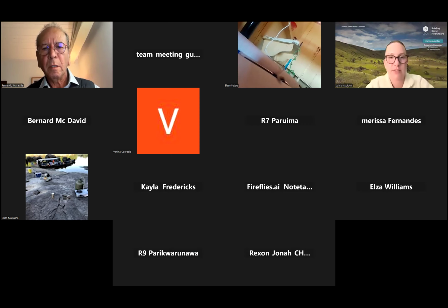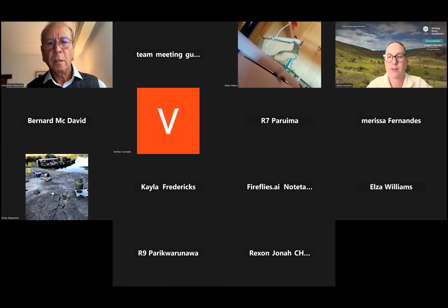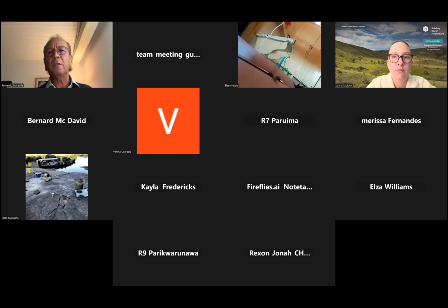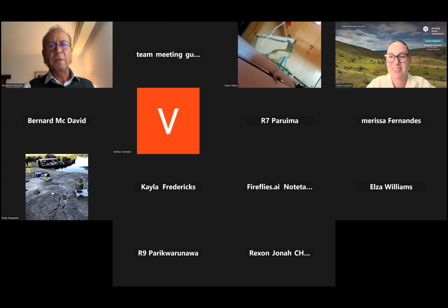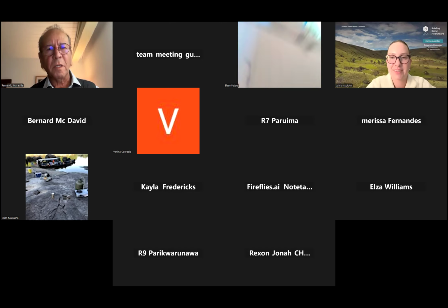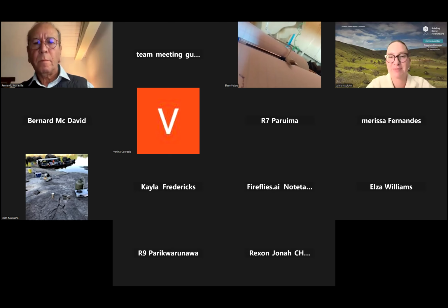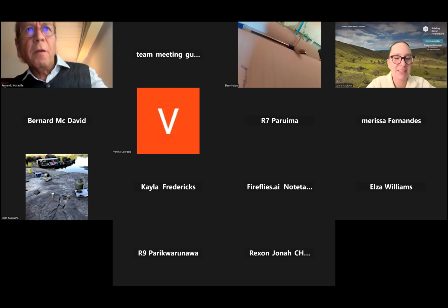Yeah, since we have it integrated in our system, there's a different workflow for how they use it, but this was really helpful. Sorry, I don't know if you can see my image or not. Yeah, we can see you. Sorry about that. I'm used to working with Google Meet, so I'm a little bit lost with Zoom. No, don't worry, I have the same with Google Meet. So, any questions?